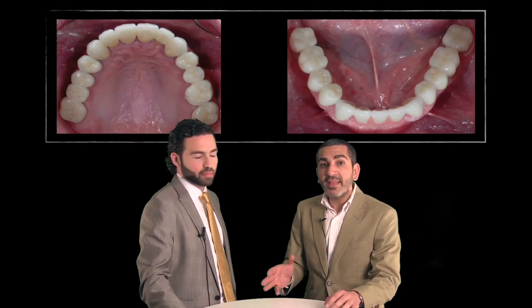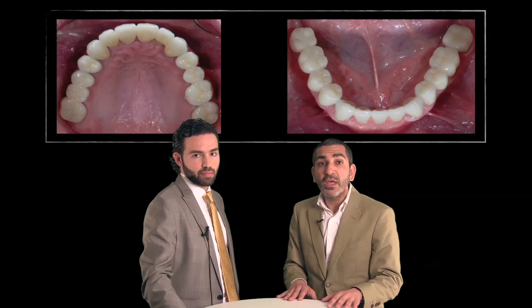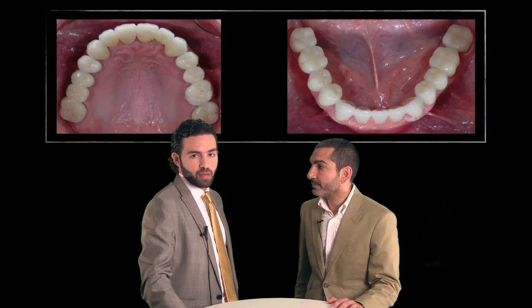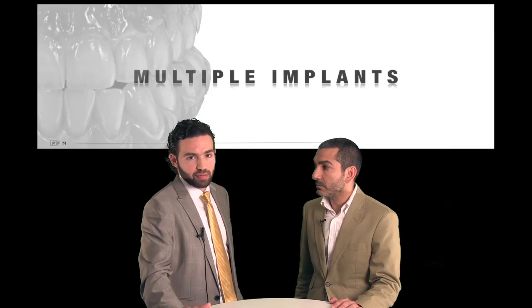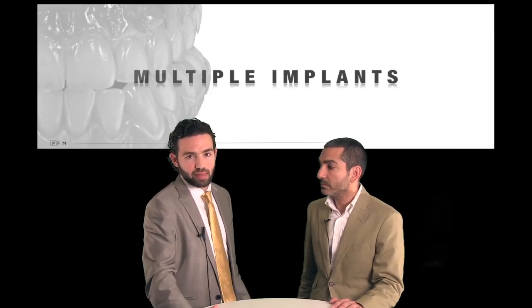So please bear that in mind, and you need to really consider that cost to benefit ratio before you start using all ceramic crowns on molar teeth. Full mouth reconstructions done on multiple implants. There's actually, up till now, I would say there's nothing better than porcelain fused to metal.